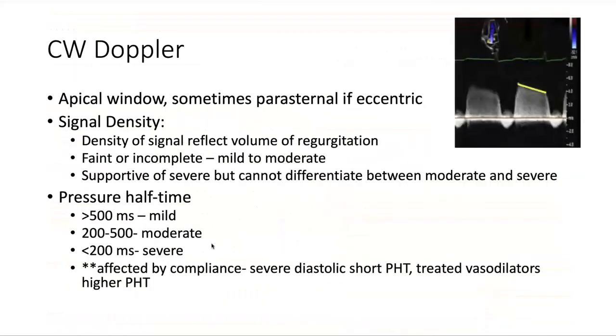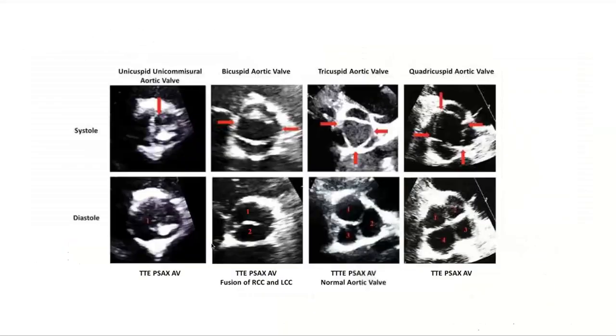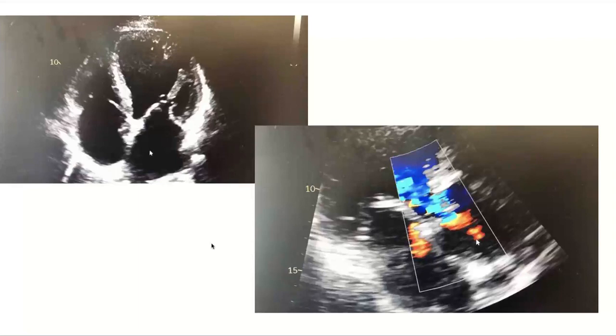Worth mentioning, just bringing back to the first case, a recent case that came through the Echo Lab, go all the way back up, but it ended up with all of these features that we just spoke about.